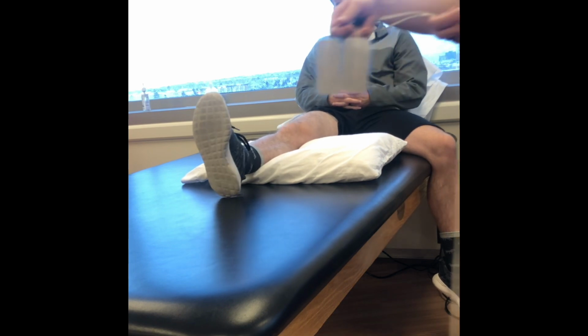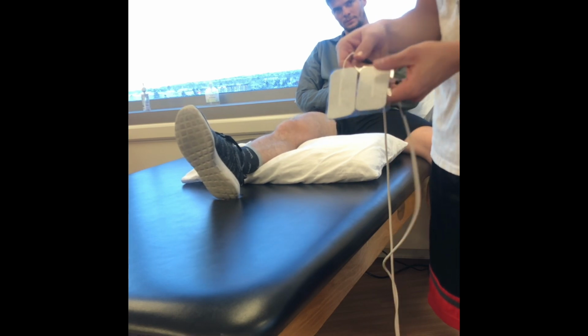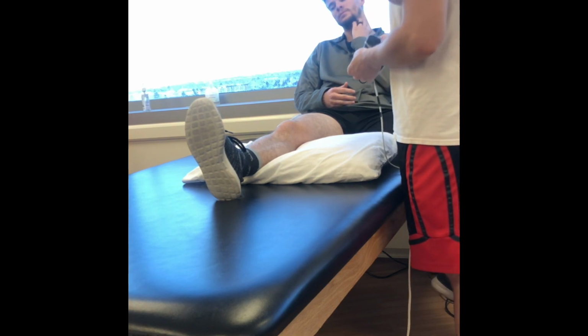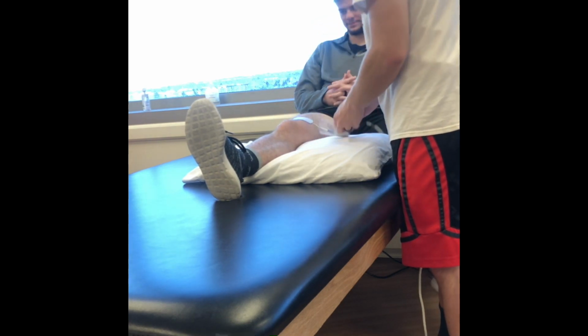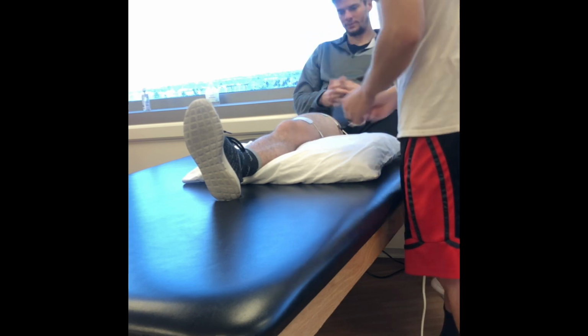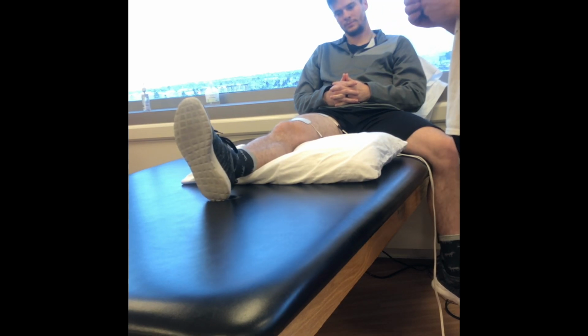So I've already got the pads set up here. On a larger muscle like the quads, you want to use the bigger pads, otherwise it can be pretty uncomfortable for the patient. So again, I don't see any rashes or any blisters or anything like that, so we'll go ahead and get started. Typically you would want to do this for like 3 sets, about 10 reps, and give the patient a break in between. For the purposes of this video, we're just going to demonstrate a couple reps just to kind of show what we should be getting, okay?